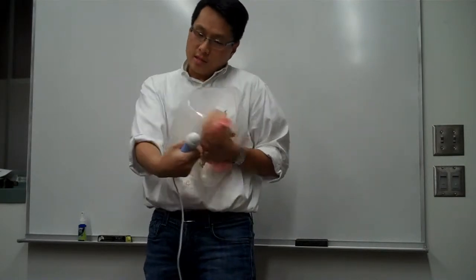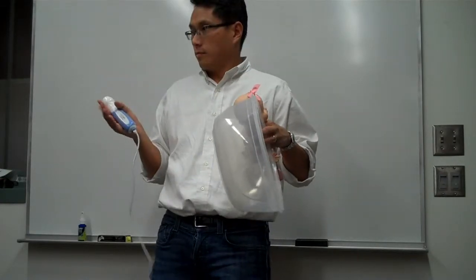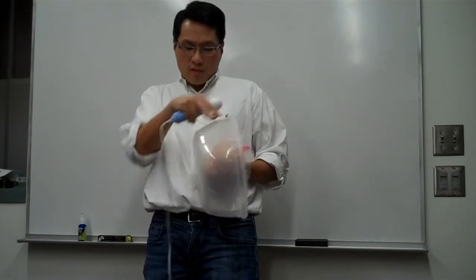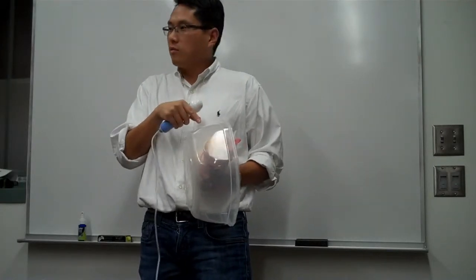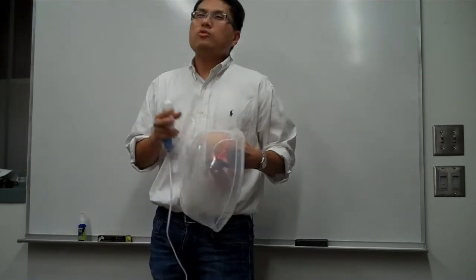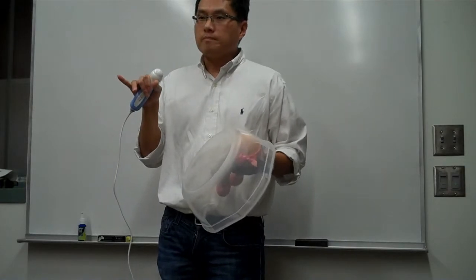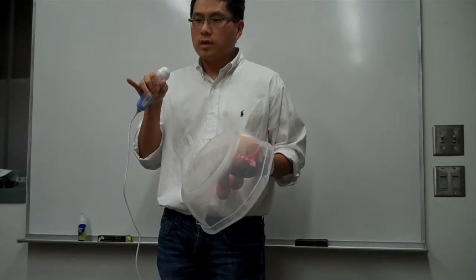Let's say the distance from the skin to the amniotic fluid is about 1 inch, because if it's too thin, you really can't see. And it's going to be scanning around 3 inches deep, so around 3 inches is where you want the center of the fetus. Okay. And then the other measurement: we're going to simulate a 20 weeks of pregnancy scan, and the fetus is usually around 6 to 8 inches. Those measurements are on the document I emailed you guys. So 6 to 8 inches.